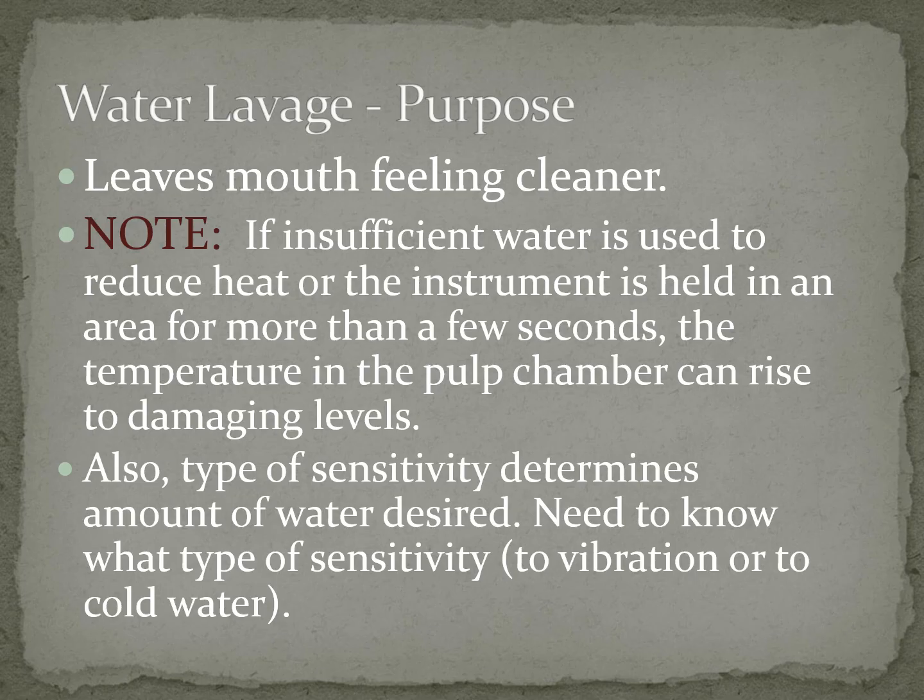Now, our water's room temperature, so at least, you know, it's not cold water, because we have self-contained units. So our water's just in that bottle. So it stays at, you know, room temperature. So we can't really change the temperature of our water, but we can increase the water, we can decrease the water, we can turn up the power, we can turn down the power. But again, all of that is going to also depend on what tip we are using.